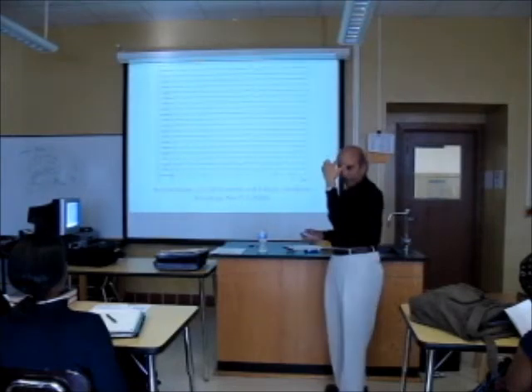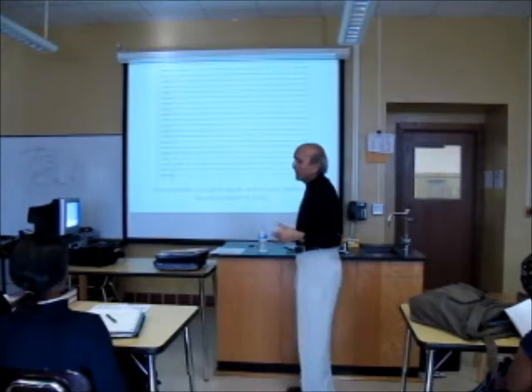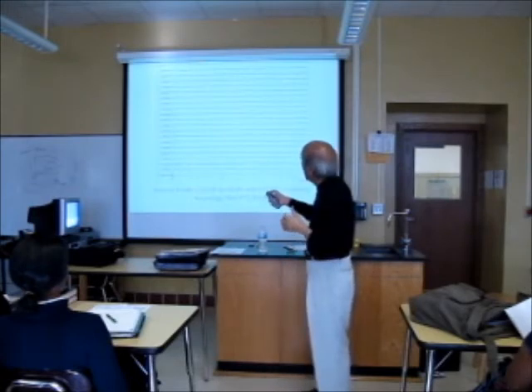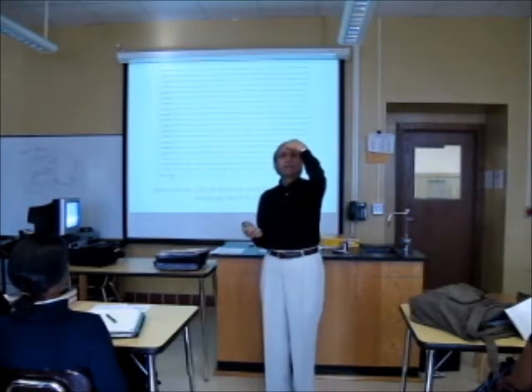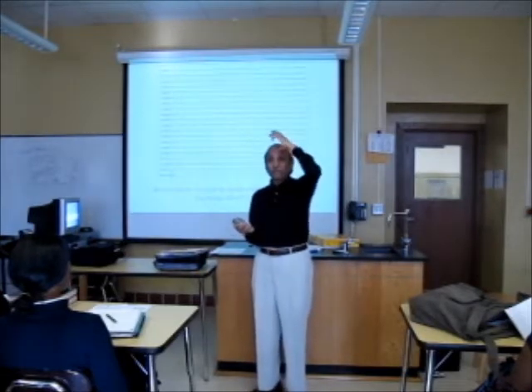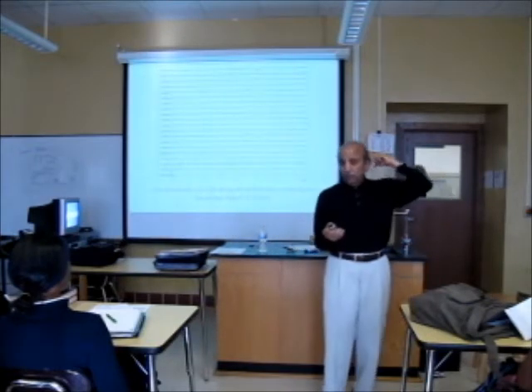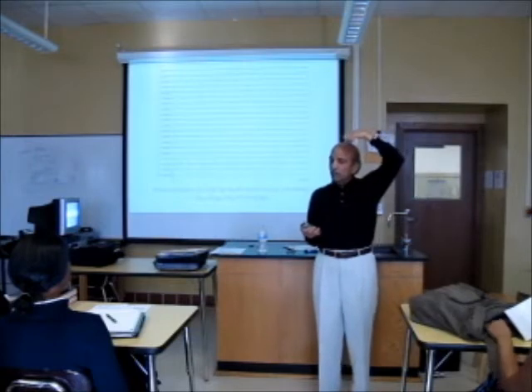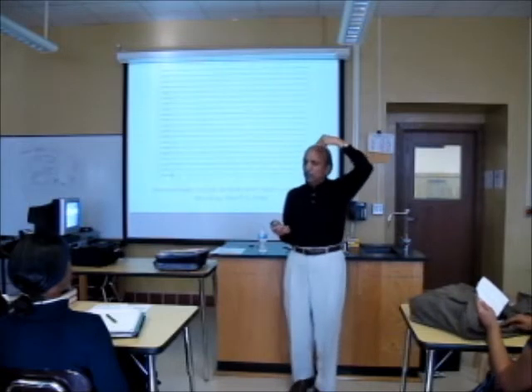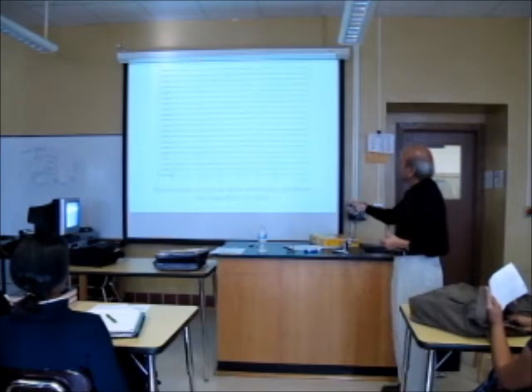These two are in the midline, like this, okay? And each one of these numbers represents a different area of the brain. For example, FP1 is just above, the frontal pole of our frontal lobe. Then we go like this, and it's the temporal lobe, occipital lobe. Here we go parasagittal, the parietal lobe, and further again the occipital lobe, the frontal lobe, the parietal lobe, and the occipital lobe. And then we compare the left side.